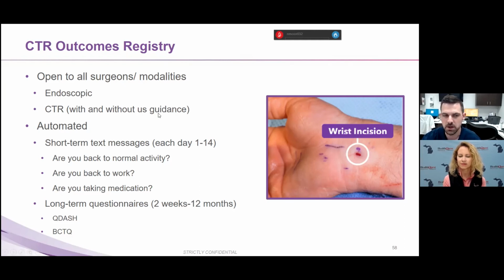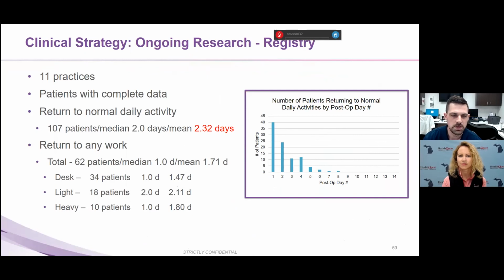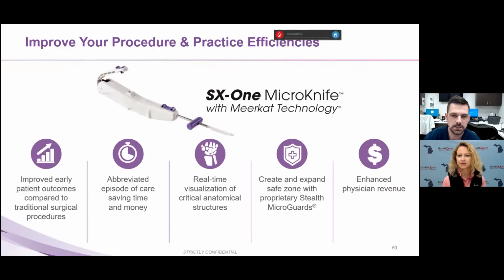So that's maybe the long-term thing, but obviously we want to track this to see that people are doing well, which they've done a pretty good job of, but then maybe you can cut out having to go to the hospital. But where we do it is relatively easy. They check in the imaging area and they get brought back, and we have a nurse and an ultrasound tech, monitoring their vitals and doing it just under local. So it's pretty quick in and out, without them having to go through pre-op and all that kind of stuff. So again, you're looking at a really quick return to work in just a few days. And so that's it. That's the long and short of it.